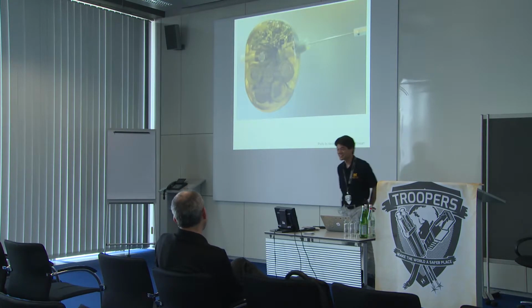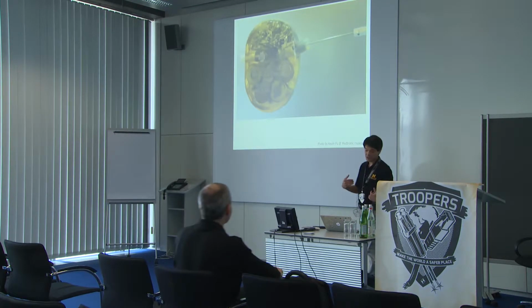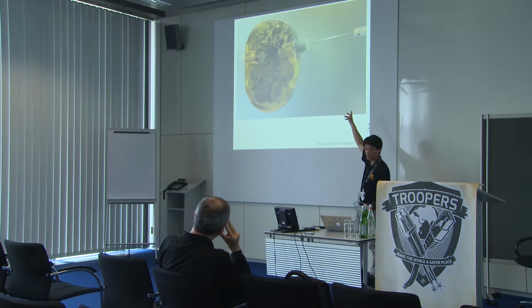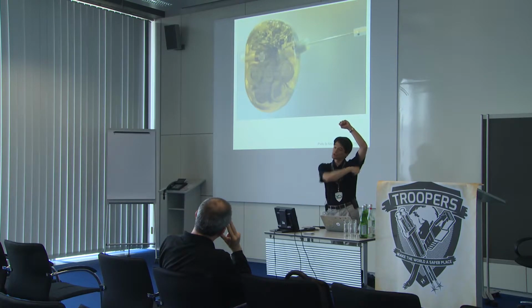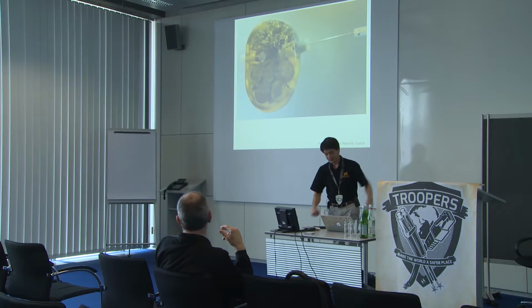The patient. Yeah. So in the old days, the way you would change the settings on an implant is that this little metal piece is not actually there to hold it up. That's actually how they change the settings. You take a needle, you ask the patient to raise their arm, you plunge it through their armpit, and then you twist a potentiometer. And that allows you to change the rate.